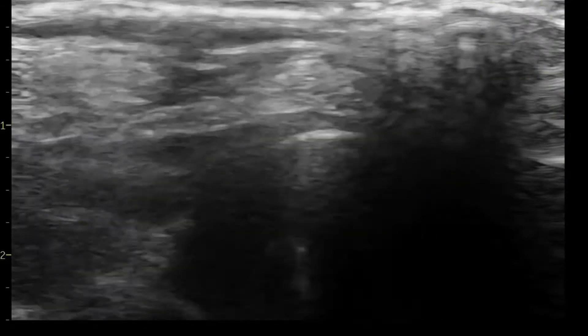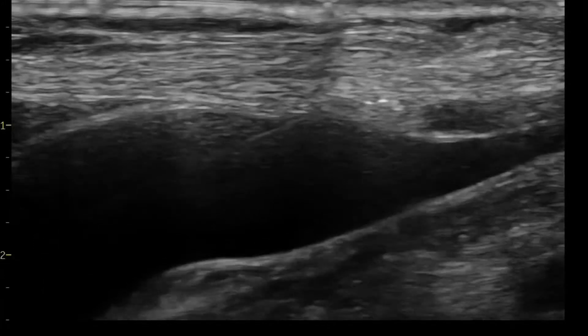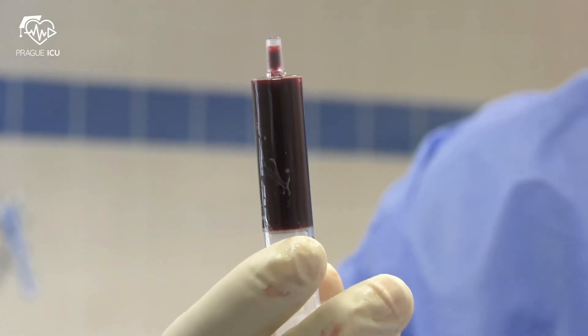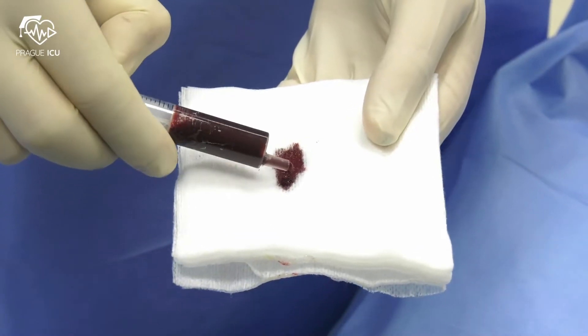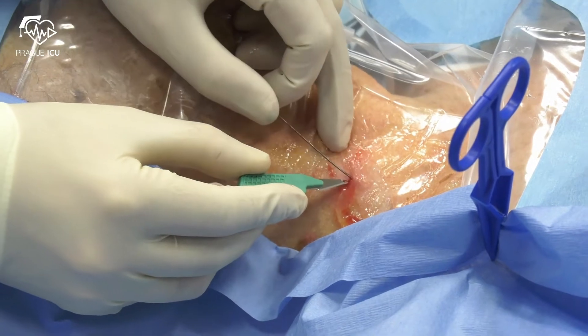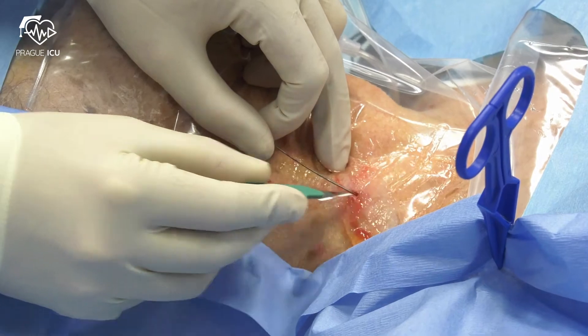Withdraw the needle while leaving the guide wire in place. Double check the position of the wire with ultrasound in transversal and longitudinal views. The dark colour of venous blood might be checked again.